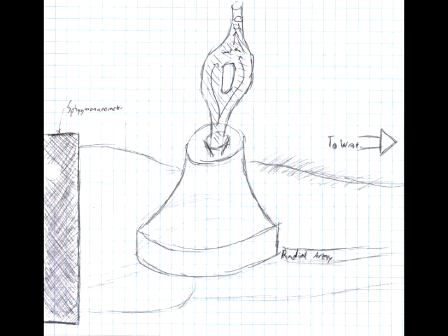For the null pressure gauge, the concept is to remove outside motion from disturbing our signal by splitting the water column and having the opposite sides push against each other. This results in a net displacement only in the vertical direction. This was ruled out due to difficulty in prototyping and manufacturing.